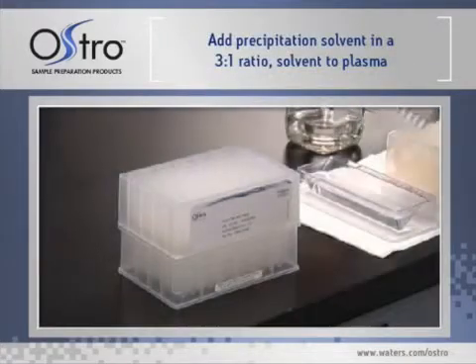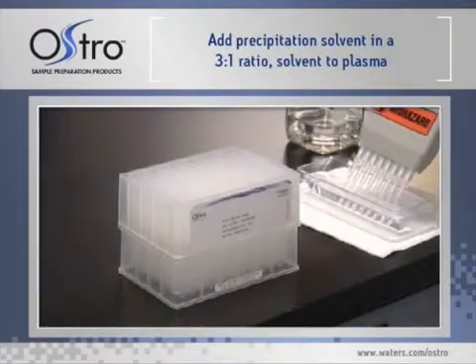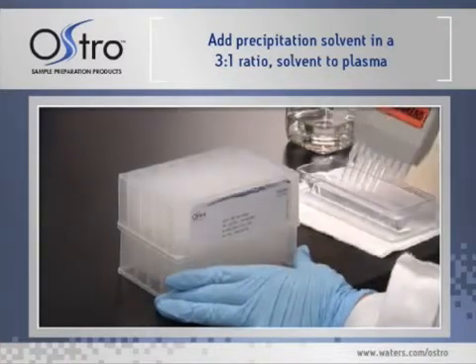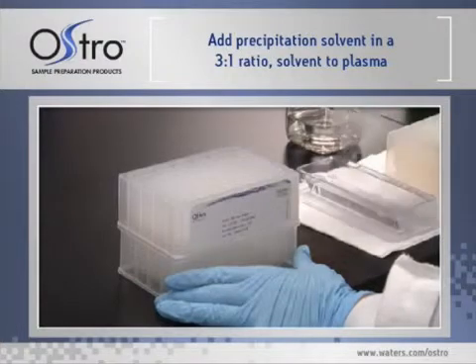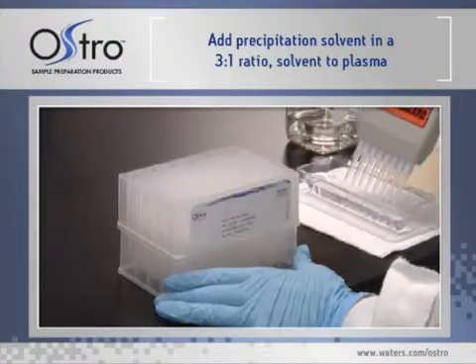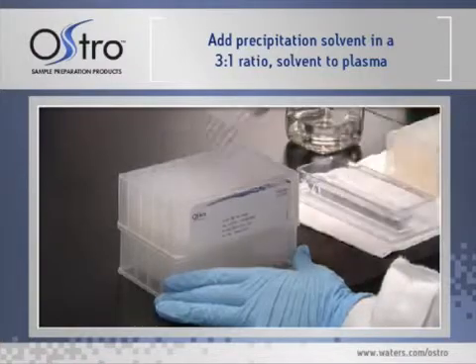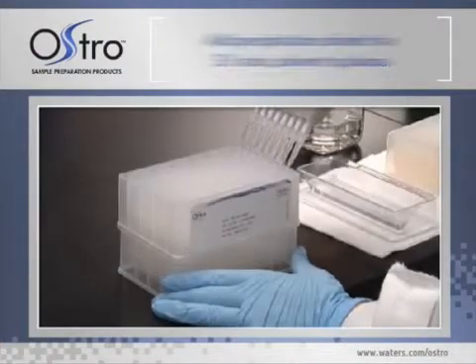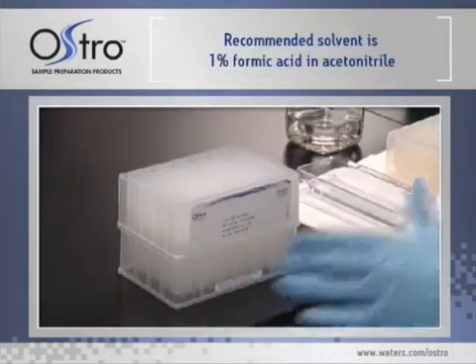Next, forcefully add precipitation solvent to the plasma in a 3 to 1 ratio of solvent to plasma. Make sure the pipette tips are properly positioned in the sample wells to avoid losing or mixing the samples. Forcefully adding the solvent will help to start mixing the plasma with the solvent. We do not recommend using methanol.